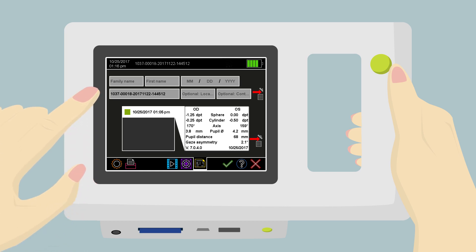After checking the measurement results, you can now start to document it. To learn more about the documentation options, please refer to Training Video 6.